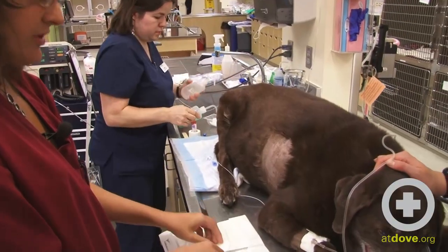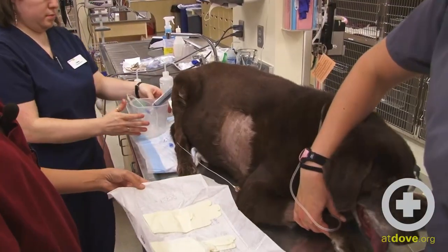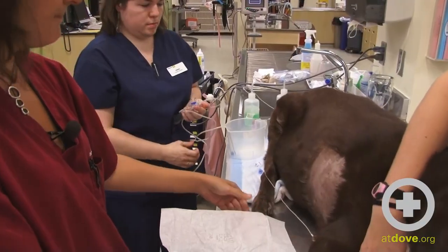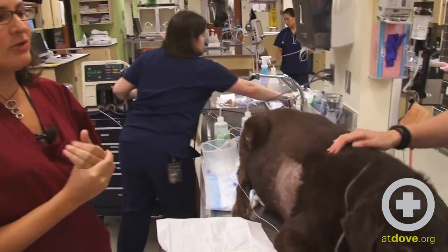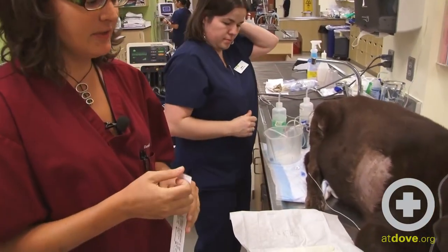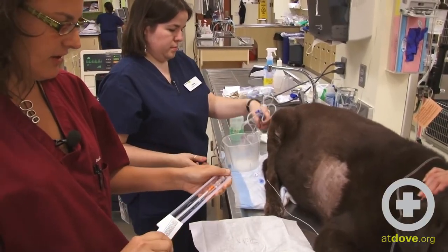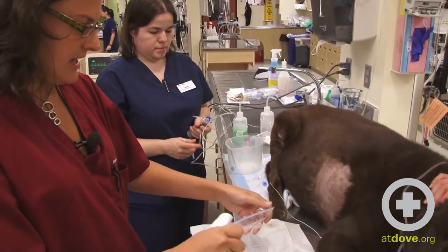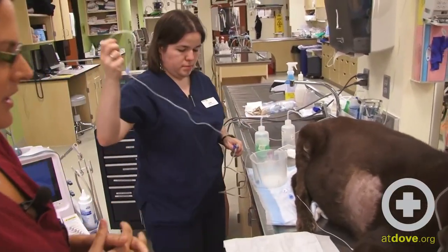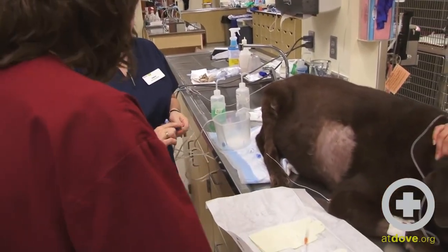So we'll start our tap. We're going to open our sterile gloves. For this size of dog, and actually most large dogs, we're going to use a 14-gauge catheter. In smaller dogs or a cat you will not be using a 14-gauge long catheter — you'll be using more of a 16 to 18. The gauge is important — it should be a large gauge catheter because you do want to get this effusion out as quickly as you can and not linger in the pericardium any longer. We've set up a three-way stopcock, which is what we will be attaching this to once we get it into the pericardium.